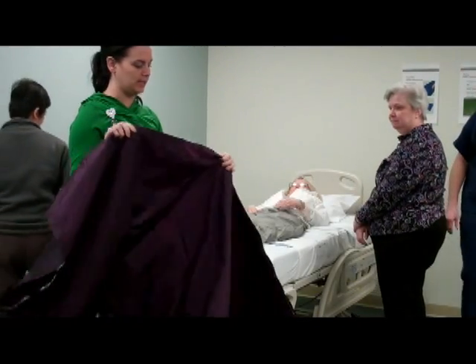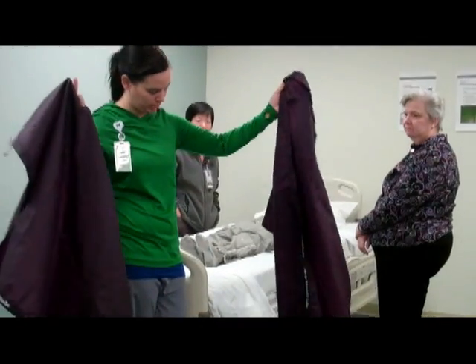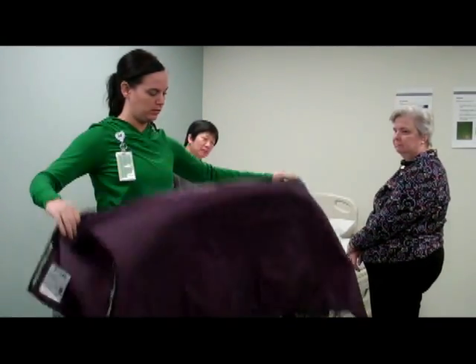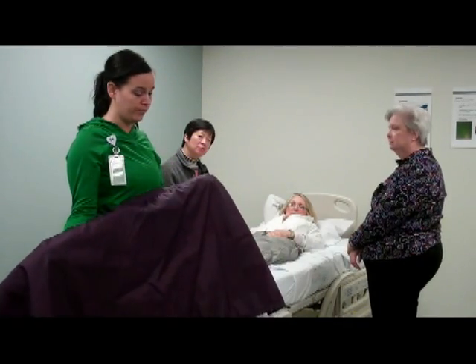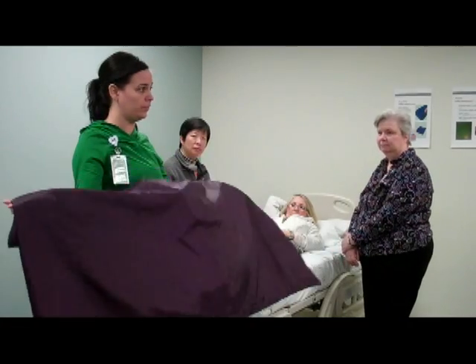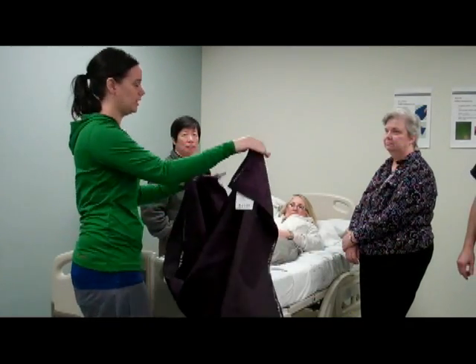Sled are basically kind of the same concept, only one is a continuous tube system, and this one is actually two separate sheets that slide on each other. Both of these are good for boosting, lateral transfers, pretty much anything you can think of under the sun to move a patient on a surface that goes like this. I don't know the official word.